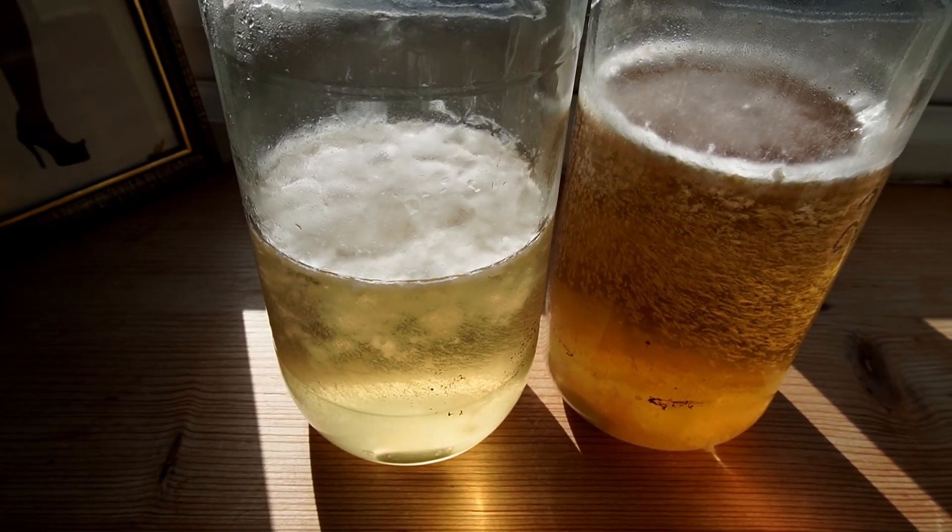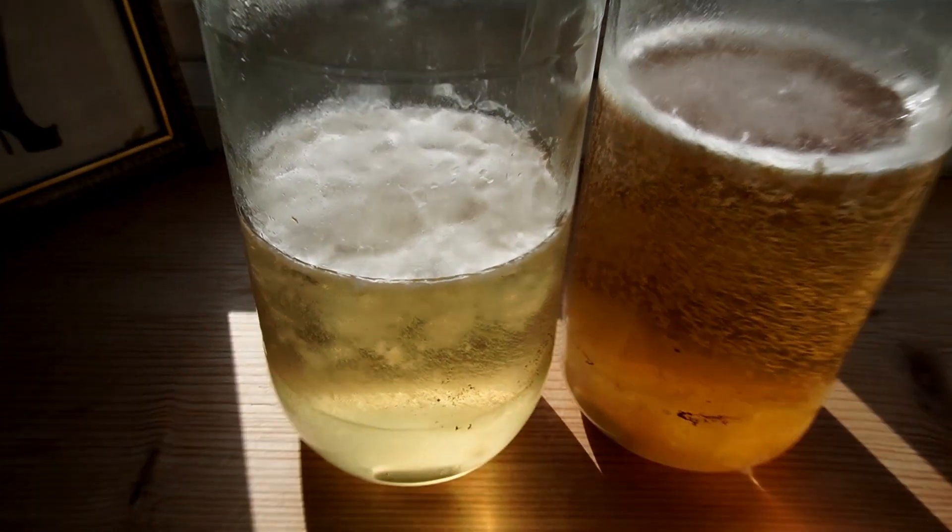In this video I'm going to be showing you how to make LMA liquid culture — that's light malt extract liquid culture — at home.